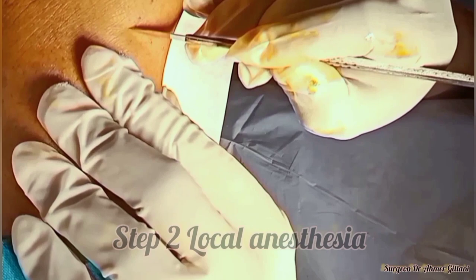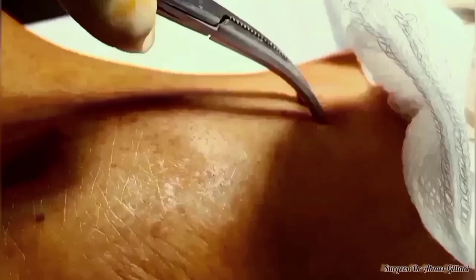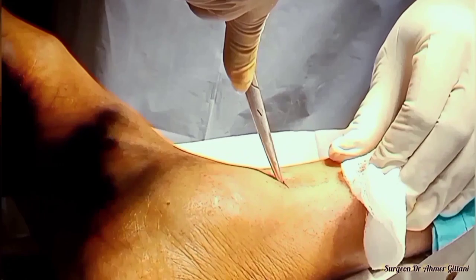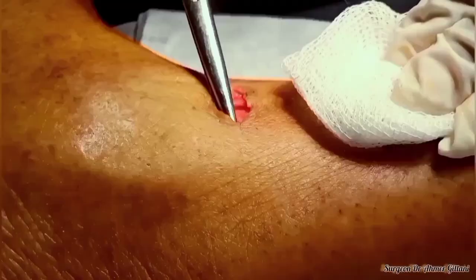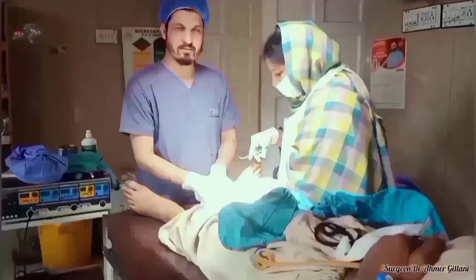The site for the venous cut down is two centimeters above the medial malleolus. We will give a transverse incision. After that, we will separate and make space with the help of artery forceps. Our artery forceps was blunt, so we are using scissors for the same purpose. If you focus on this incision at the middle, you can easily detect the vein.